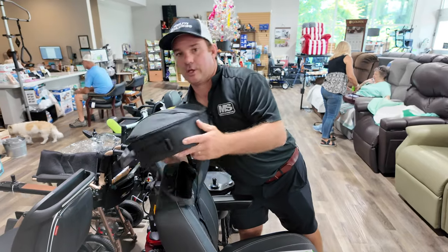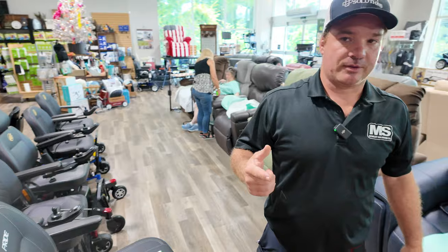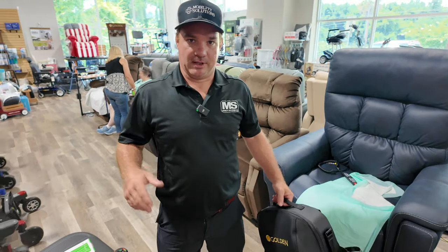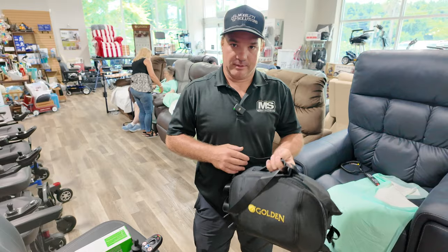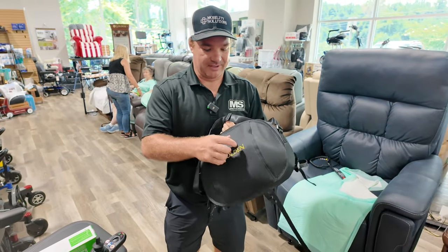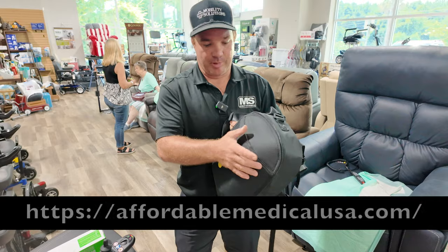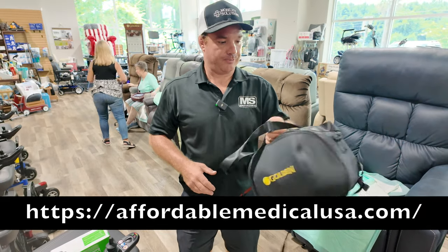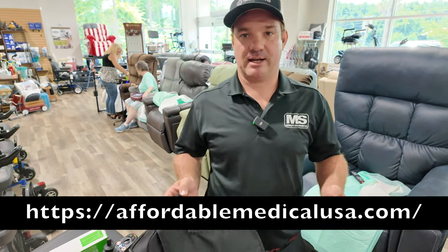If you're looking for a nice little portable bag for a small scooter, like a Go-Go, a Buzz Around XL or EX, something like that, check out this little bag. You'll like it — it's a nice bag. They call it a hard shell, but it's not too hard; it's just like a little piece of plastic in there that kind of bubbles itself out. We like them. They're about 69 bucks. Check us out at affordablemedicalusa.com.